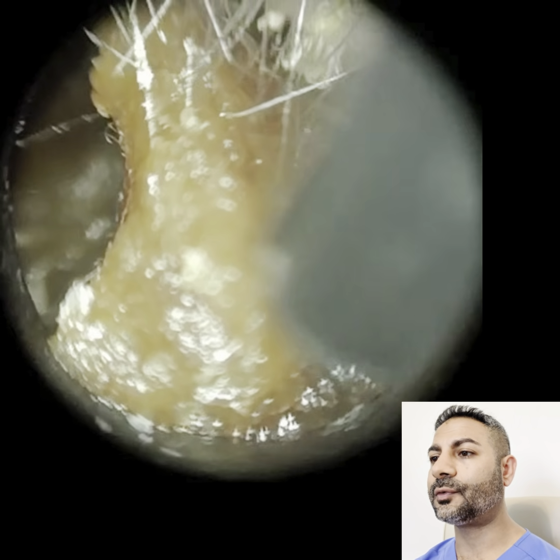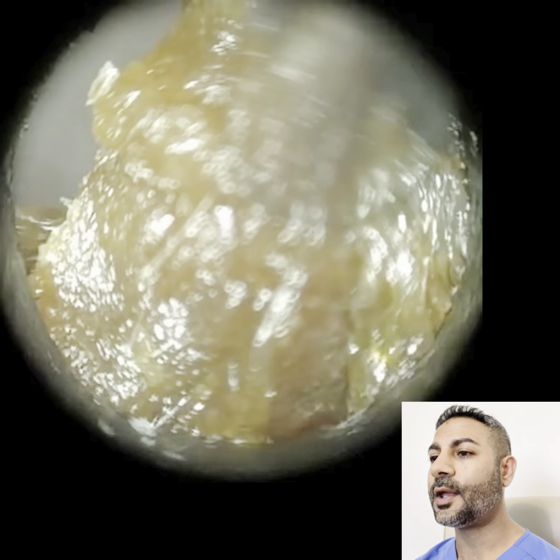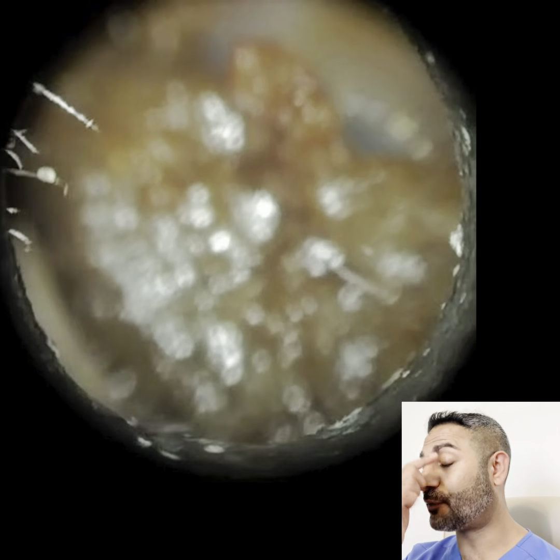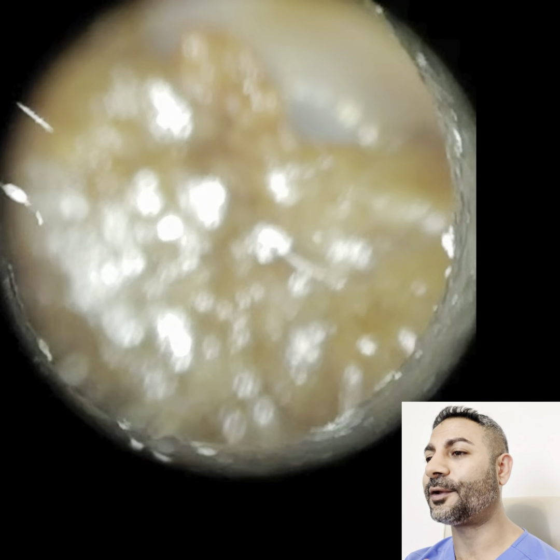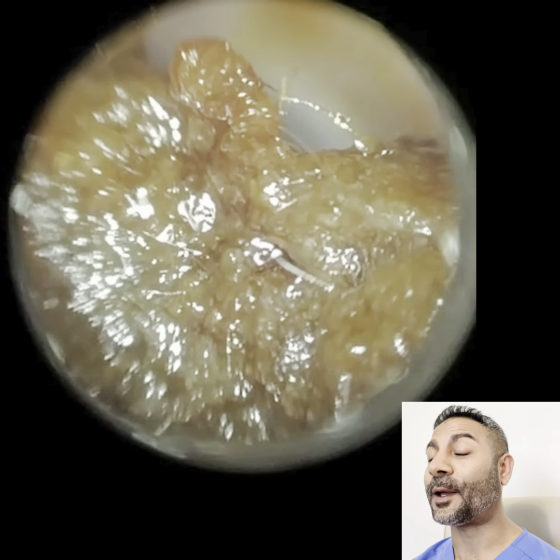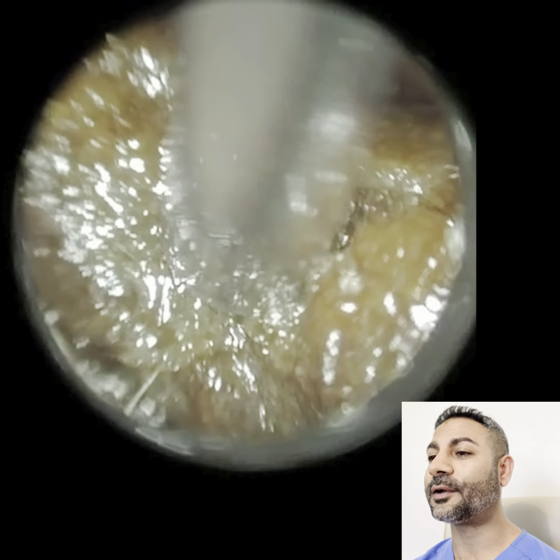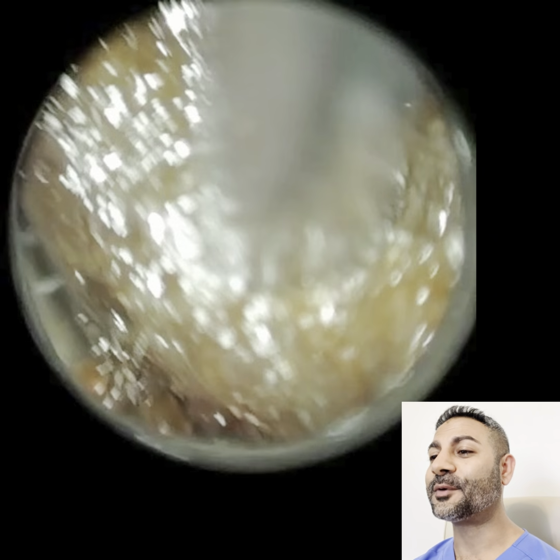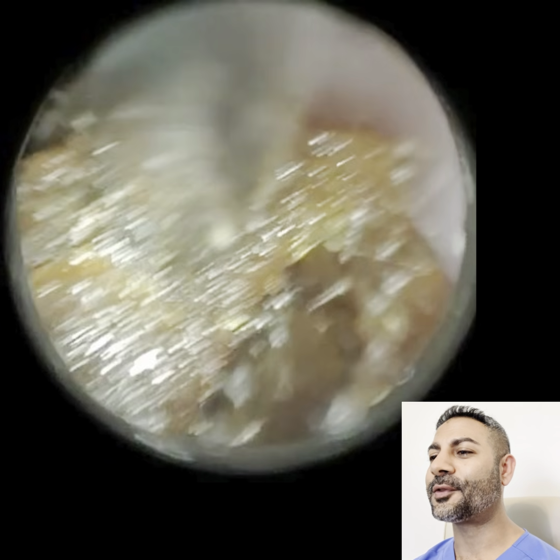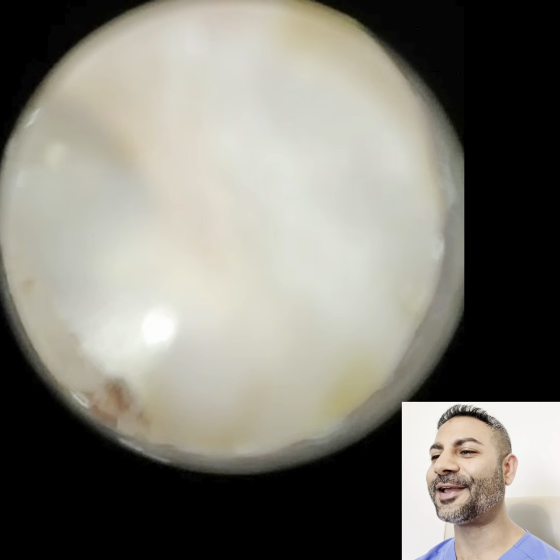I think the wax more immediately was a bit softer. The patient had been using some drops. The patient is a police officer, so they've been struggling to hear with the radio piece. They normally wear it in their left ear, and advised me that his mum's a retired nurse, and I showed him the metal ear syringe that I've now got in the clinic, which got given to me as a gift by another patient. And he said, yep, that's what mum used to use many, many years ago. And the patient's mum is still a bit of a fan of irrigation.